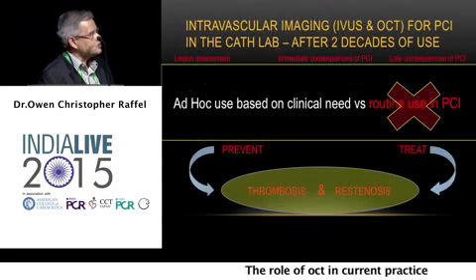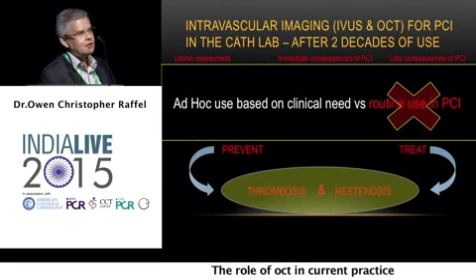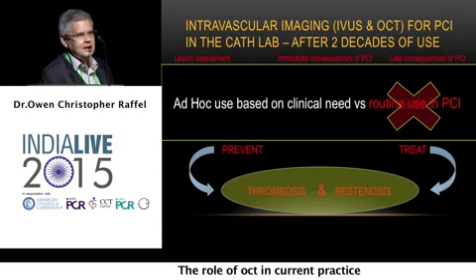So in conclusion, with regards PCI, I don't think you can justify using OCT or IVUS routinely for every single PCI. I don't think we have good data to support that. But for ad hoc use, where there's a clinical need, most certainly.